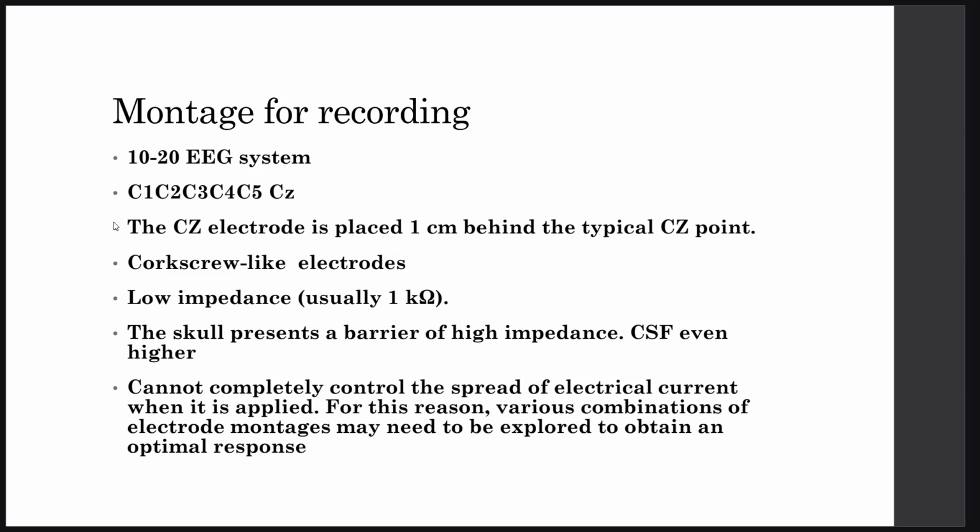It means that when you are performing motor evoked potential, routinely you should accurately point these 4 points, C1, C2, C3, C4. It is the same as in EEG. Why do we take meticulous attention to stimulation points in MEP? Because the site of the active cortex is very limited. It is not like SEP.